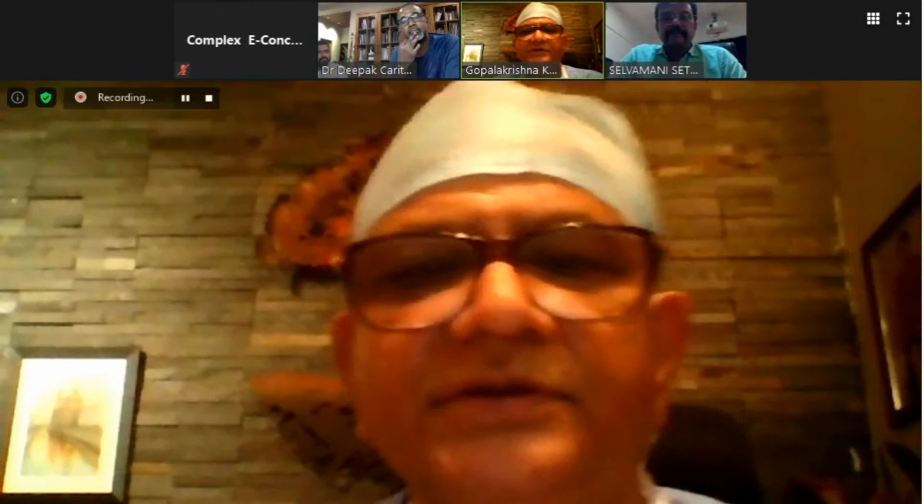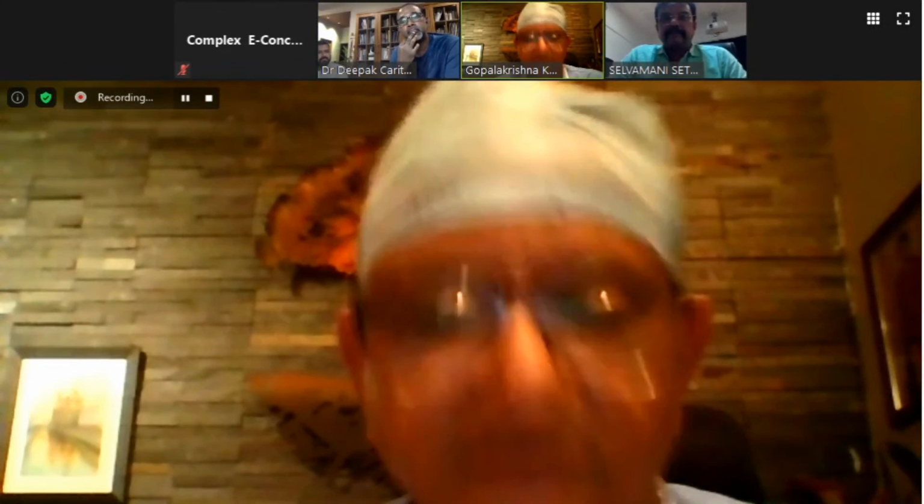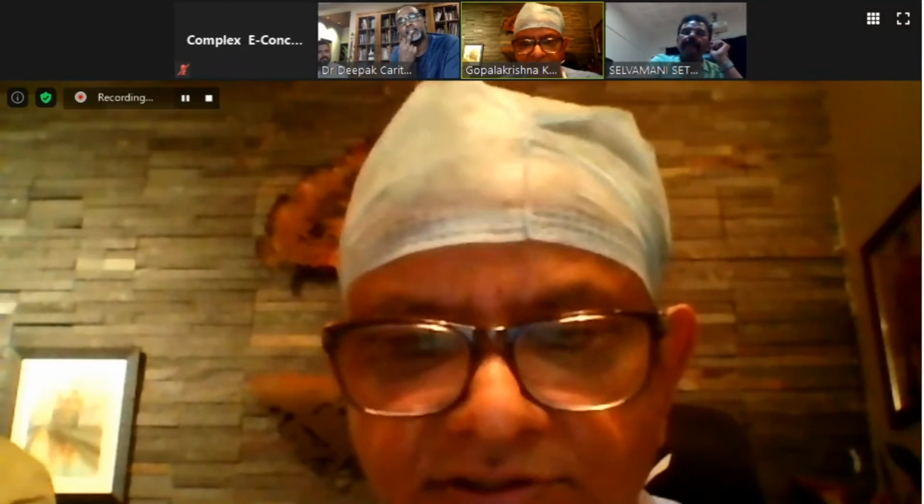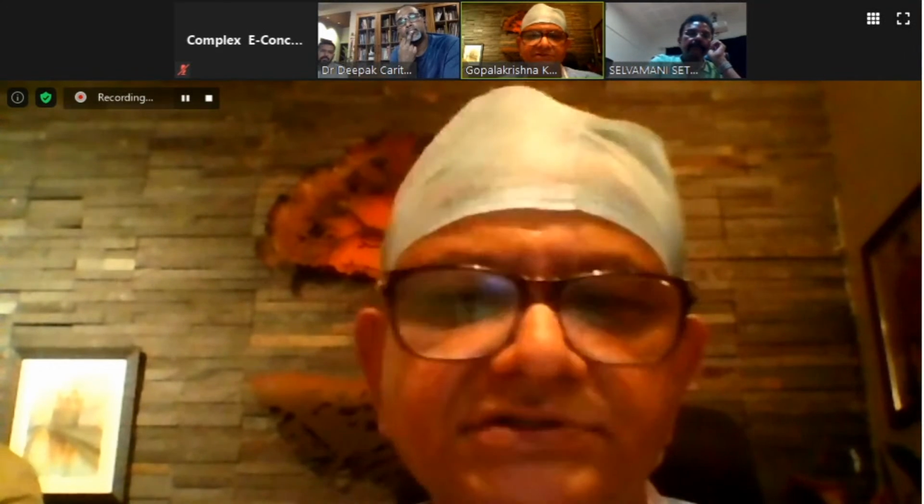Yeah, thank you. That means we are talking about acute coronary syndrome, where the diameter stenosis and all those things do not matter after balloon dilatation and thrombosuction. Probably what we are saying is, if you do an OCT, which is a good tool to differentiate between erosion and rupture: if you have a rupture, stent it. If you have an erosion, leave it alone. That's probably the point you are trying to make.